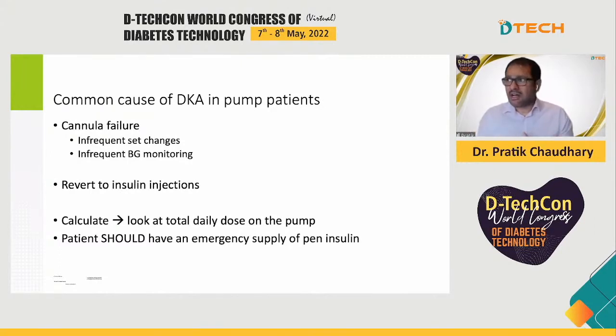Or a classic one is, I've had a number of patients who late at night, their sugar's been high before bedtime, they've had a reading of 300, 350, they've done a bolus correction, and they've gone to sleep. Or they've even changed their cannula and gone to sleep.